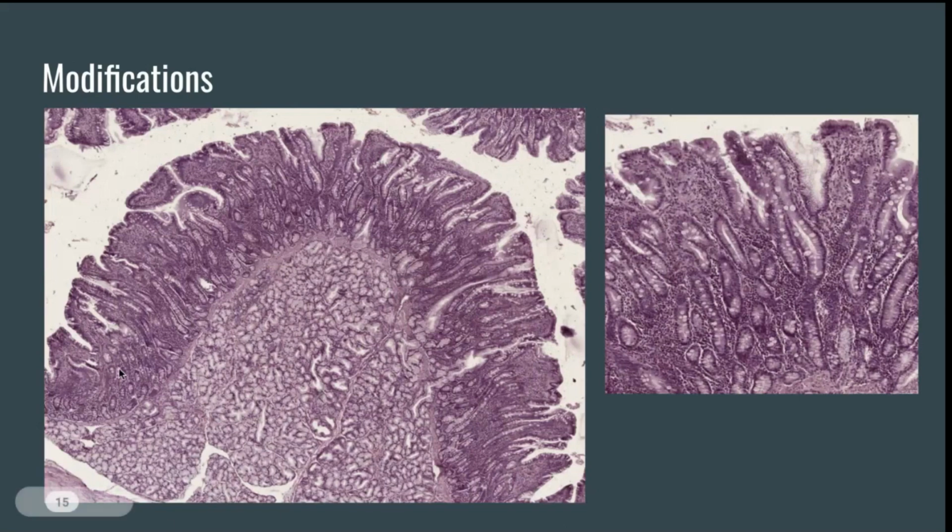And next we have the intestinal villi. These slender structures are called the intestinal villi. So this is one villus, this is the second, this is the third. In the duodenum, a lot of them are present. They are slender and have a characteristic leaf shape. The third thing is that it has microvilli on the enterocytes, but you can't really see them over here. You can only see them in electron microscopy.